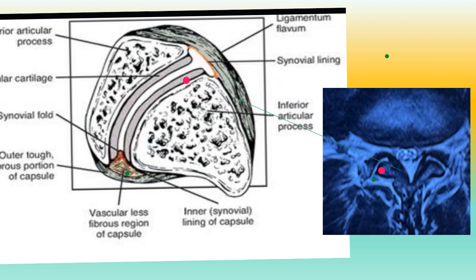Then facet anatomy: the L shape of the SAP, and there is the joint space. Then this bulbous part is the IAP, inferior articular process. This is IAP, SAP. This is like a C. So sometimes this overhangs, sometimes this facet joint cyst enlarges and compresses the traversing root, and the ligamentum flavum buckles, hypertrophies, and this causes stenosis.